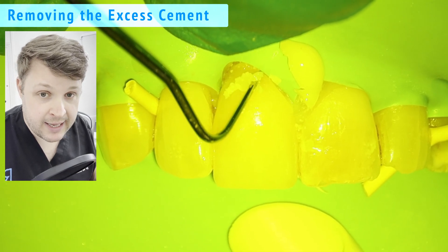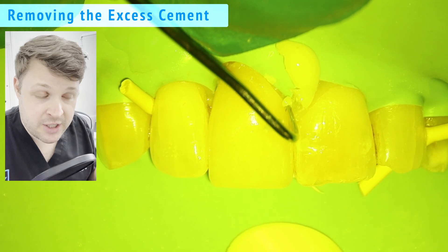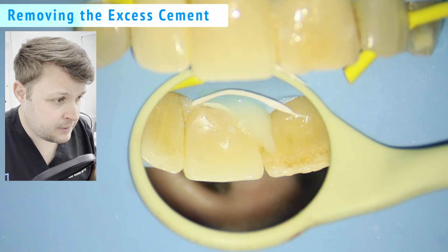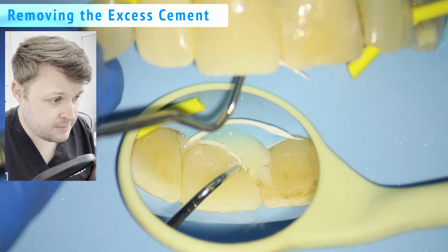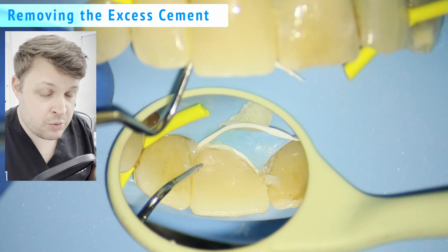I have to be super careful here because the last thing I want is to nick the gingiva and make it bleed, as that's going to affect the bond surface. Moving to the back and again removing the excess — this cement is dual cured so by this point it's probably set completely.